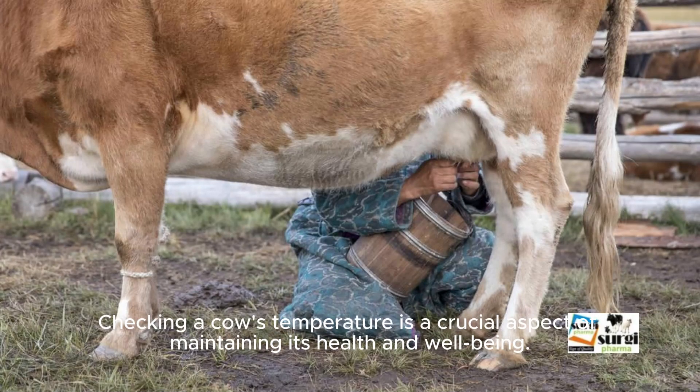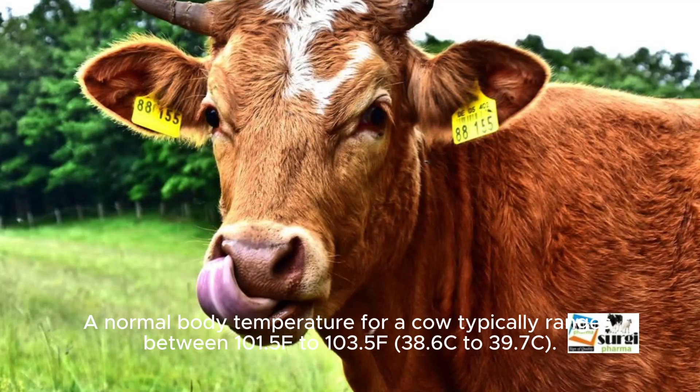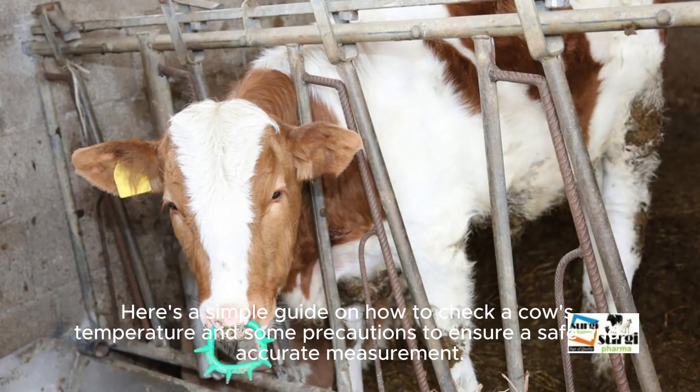Checking a cow's temperature is a crucial aspect of maintaining its health and well-being. A normal body temperature for a cow typically ranges between 101.5°F to 103.5°F (38.6°C to 39.7°C). Here's a simple guide on how to check a cow's temperature and some precautions to ensure a safe and accurate measurement.